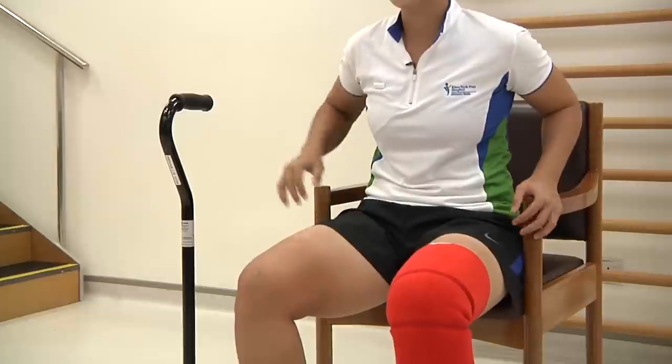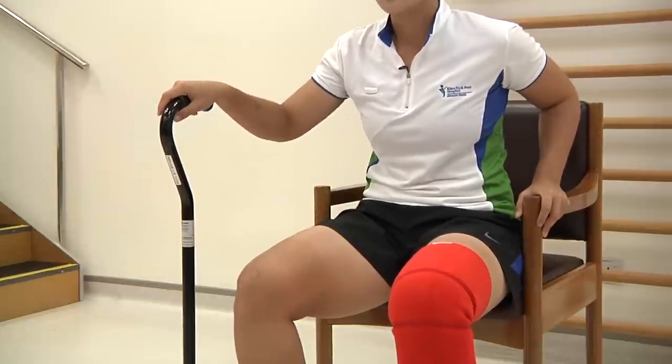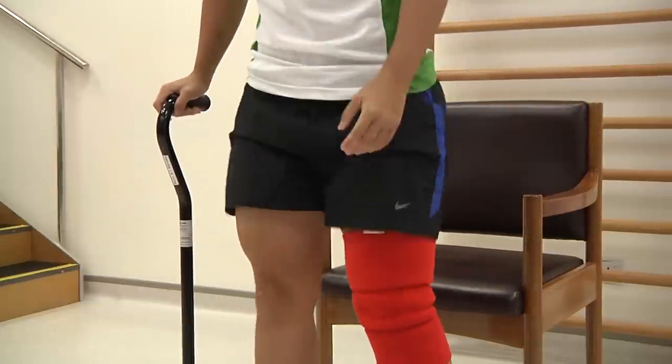To stand up, place the stick on the non-painful leg, shift yourself out to the edge of the chair, place one hand on the stick, one hand on the chair, lean yourself forward, and stand up. When standing up, place the hands at the side of your body.